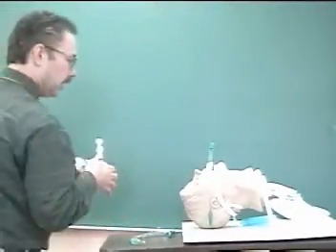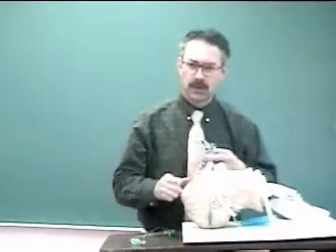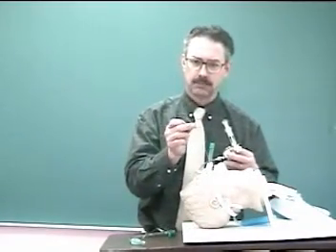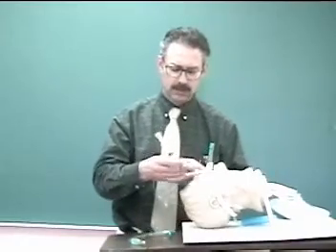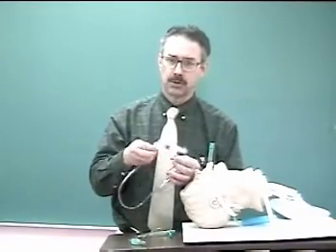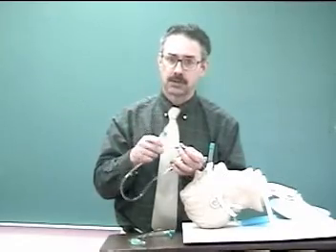Together it allows us to check the pressure of the endotube cuff. Each endotube has a pilot balloon. We connect the cuff manometer by way of the stopcock to the pilot balloon.